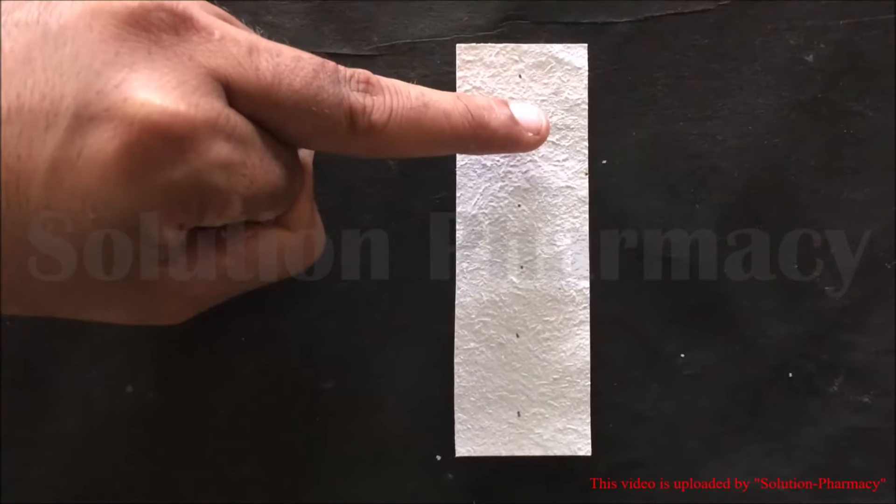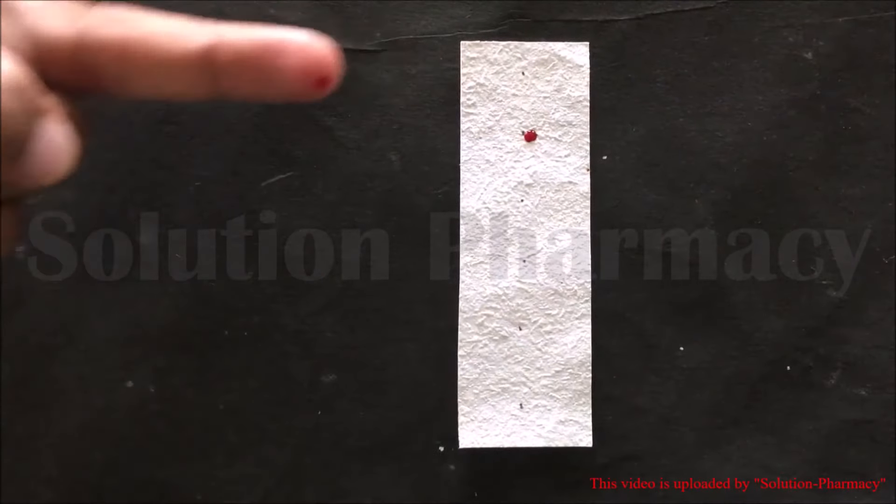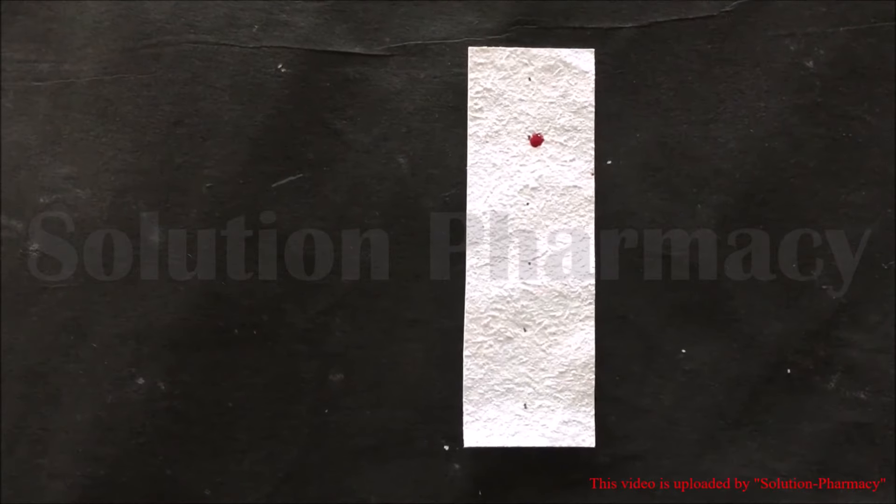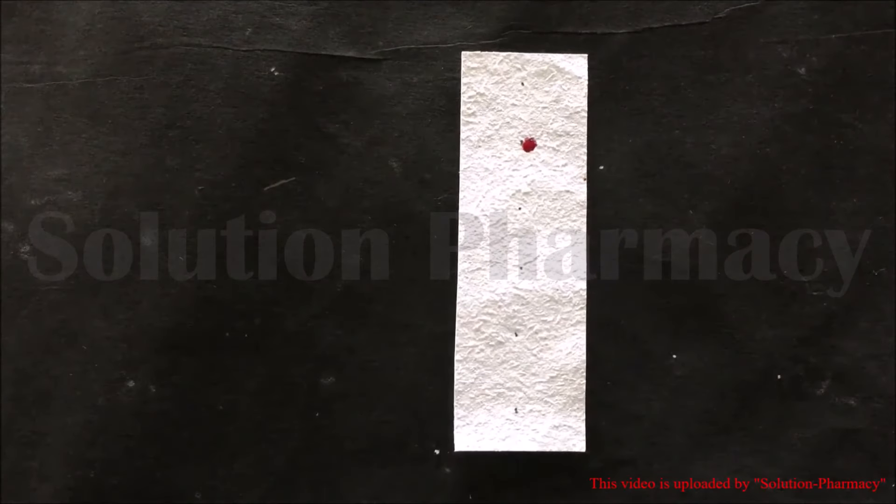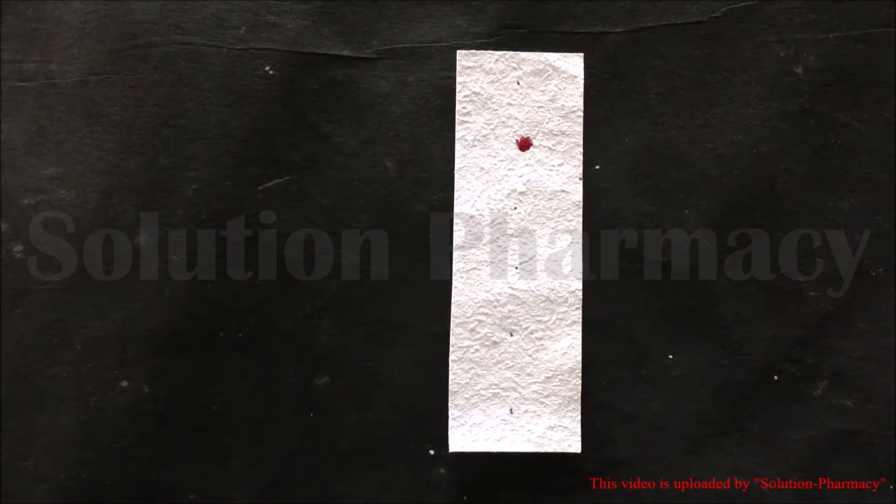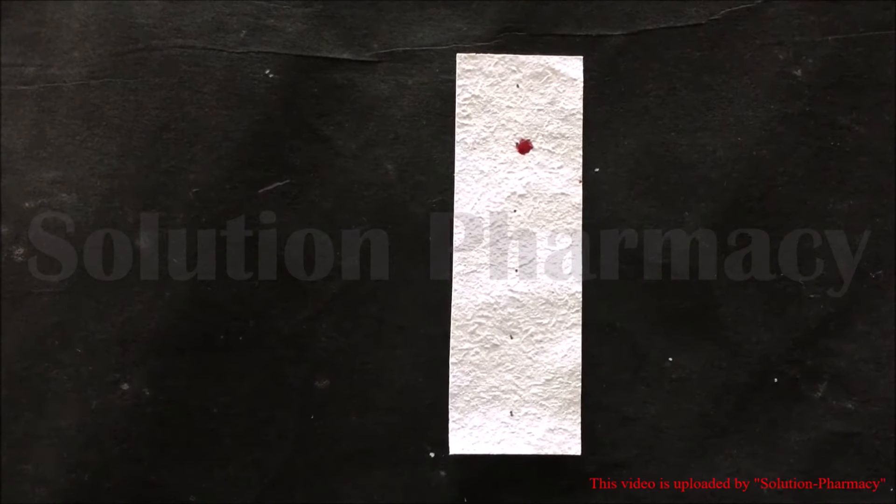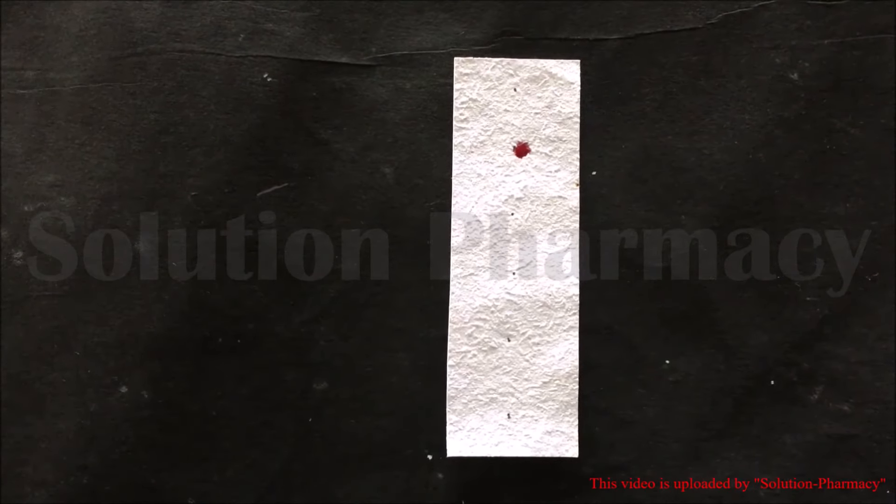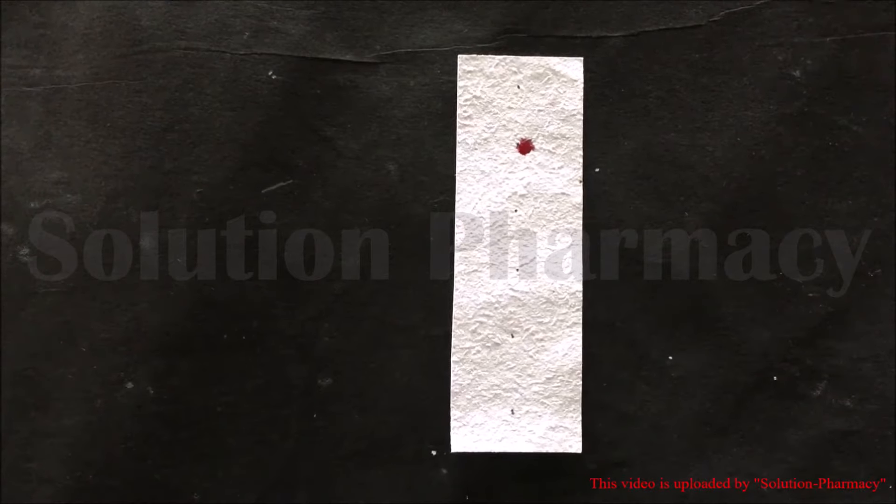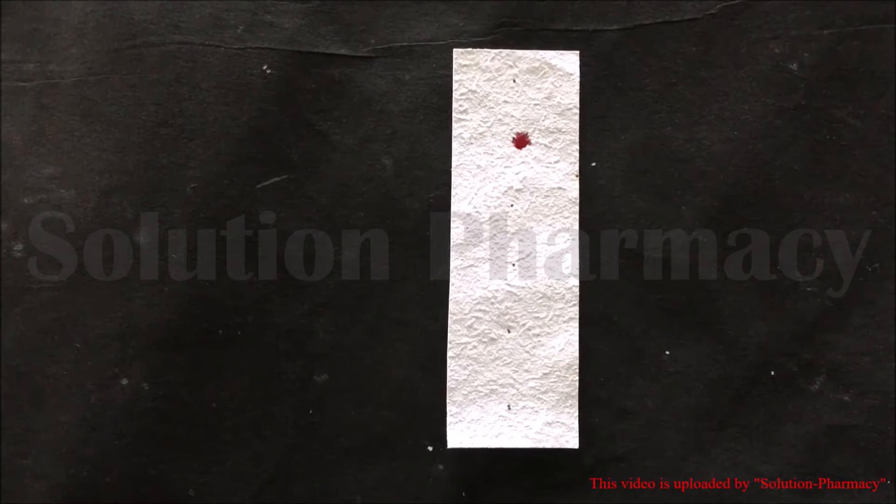Apply the drop of blood from the finger on filter paper by slightly touching the pricked side of the fingertip on filter paper. The filter paper will absorb the blood from the fingertip. Do not press or squeeze the finger during this process.